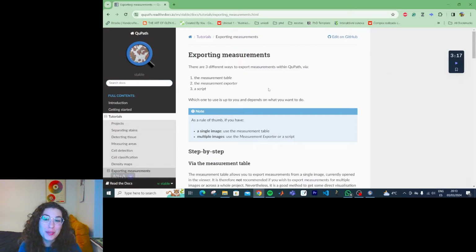Hi! Today we're going to be following this tutorial on exporting measurements, and by the way, if you haven't seen it, Pete, my boss and the creator of QuPath, is actually uploading videos answering some of the questions that have popped up during this series. So it's probably a good idea that you check them out, because he's giving us some more tips, tricks and ways around the more frustrating bits that you'll probably find useful. I found them very useful. But yeah, today we're doing exporting measurements.